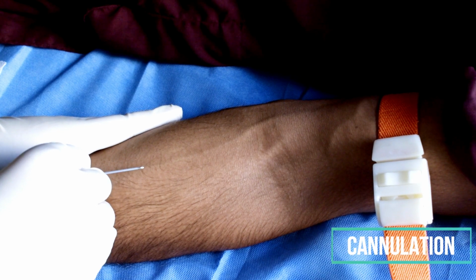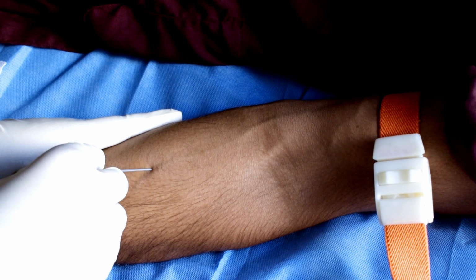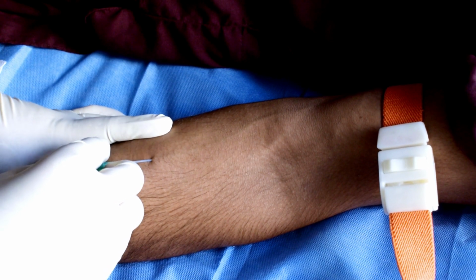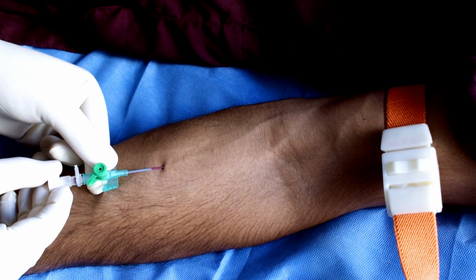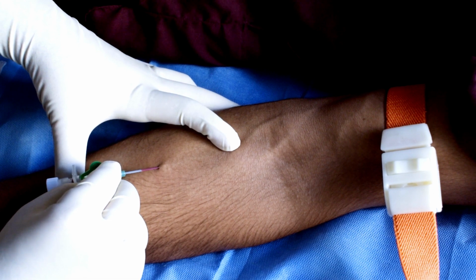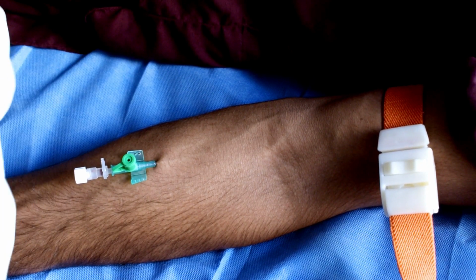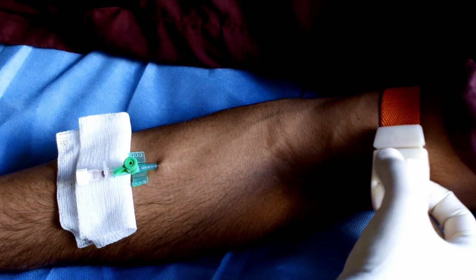The skin is stretched to straighten the vessel, and now a small part of the catheter is inserted parallel to the vessel. Once there is a flash, the cannula is pushed slightly within the vessel and the stylet is pulled slightly backward, and then the rest of the cannula is pushed within the vessel. Below the luer connector, a gauze is placed to prevent the spillage of blood all over the site. The tourniquet is now released.